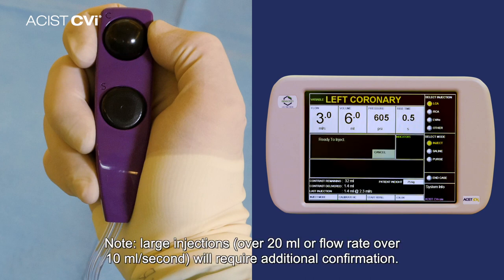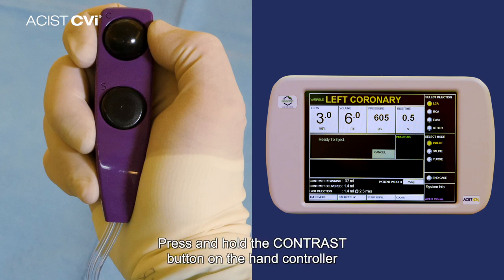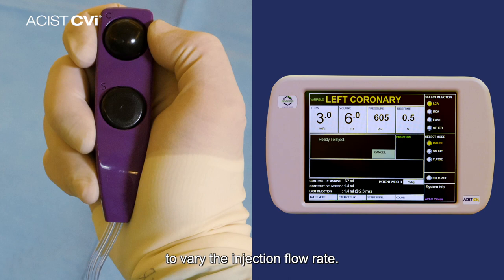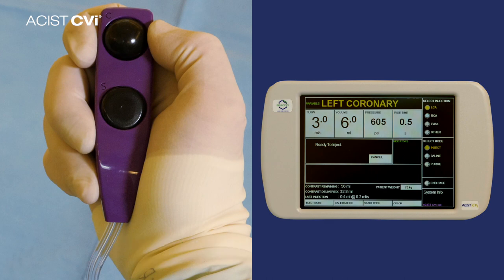Note: large injections, over 20 mL or flow rate over 10 mL per second, will require additional confirmation. Step 3. Injecting. Press and hold the contrast button on the hand controller to vary the injection flow rate. Releasing the contrast button after the desired image is achieved will stop the flow of contrast.